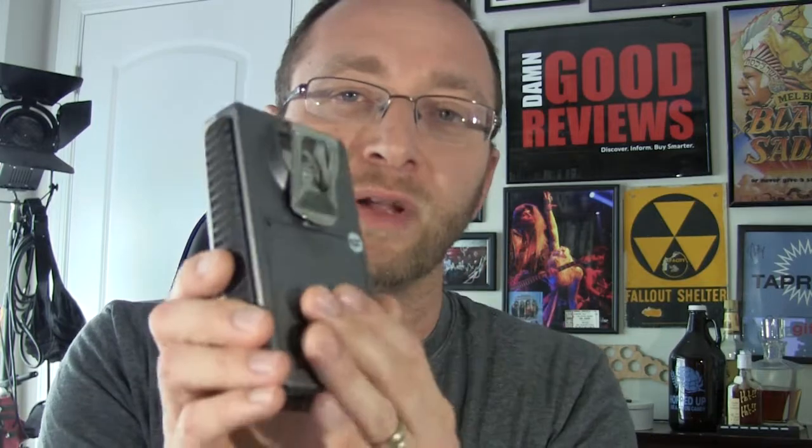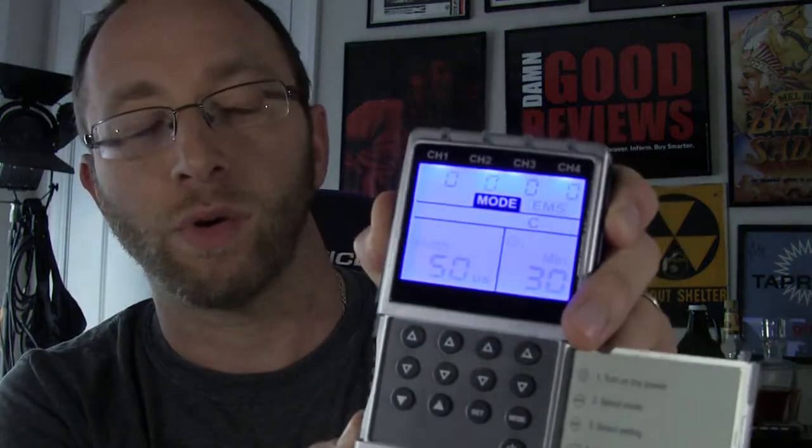It goes right in that case there with all cut-out foam inside. Here's the device itself. To give you an idea of the size, it's about the size of what a Nintendo Game Boy used to be — can't play anything on it though. It does have a built-in rechargeable battery as well as a little belt hook so you can hook it on your pants. There's a USB charger on the bottom and it comes with a USB cable. Up top is where all the pads plug in, and if we flip it open there we have the display showing your settings, power, and different modes.